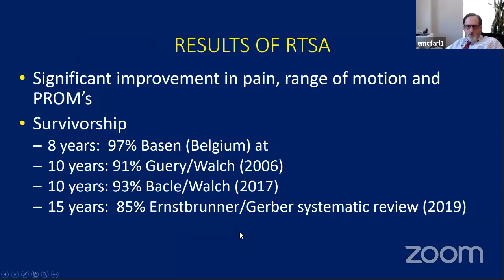So the good thing about reverse total shoulder arthroplasty is there's not only significant improvement in pain and range of motion, but also patient reported outcomes. Patients with reverses actually do quite well, and many of them are very satisfied.